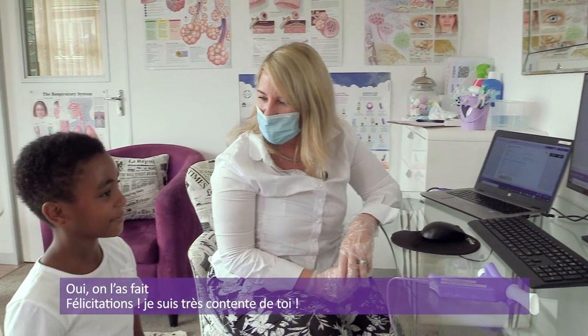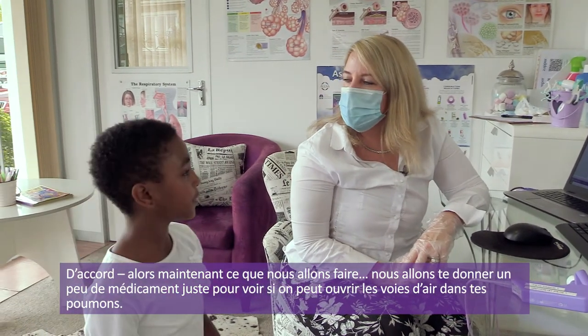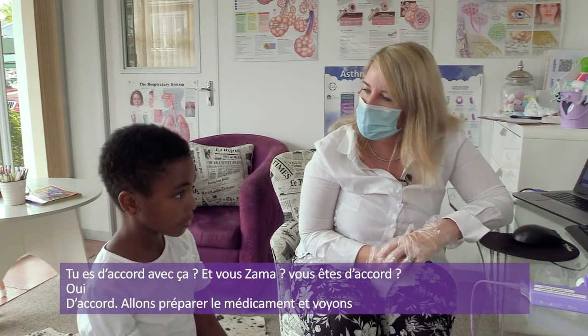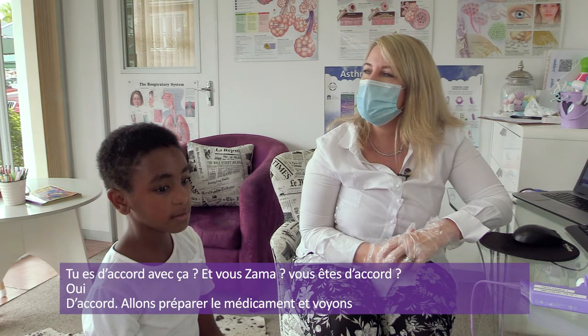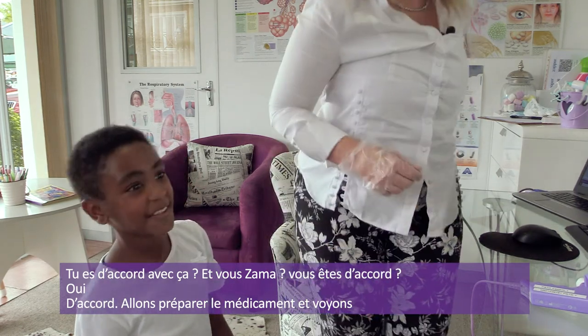Very happy with you. Okay, so now what we're going to do is we are going to give you a little bit of medication just to see if we can open the airways in your lungs. Is that okay with you? You all right with that, Zama? Yes. All right, so let's get that medication and let's have a look.